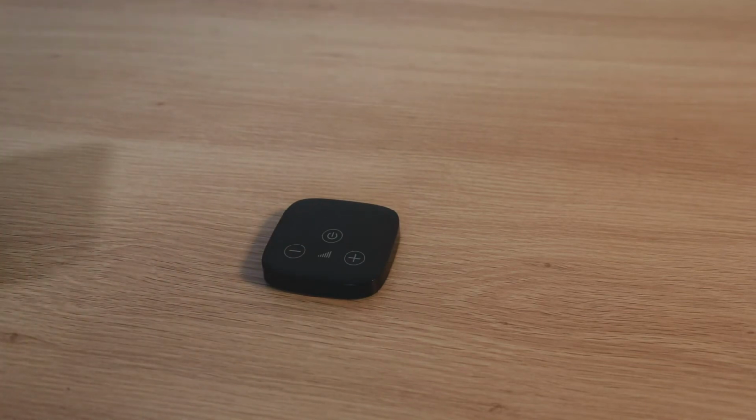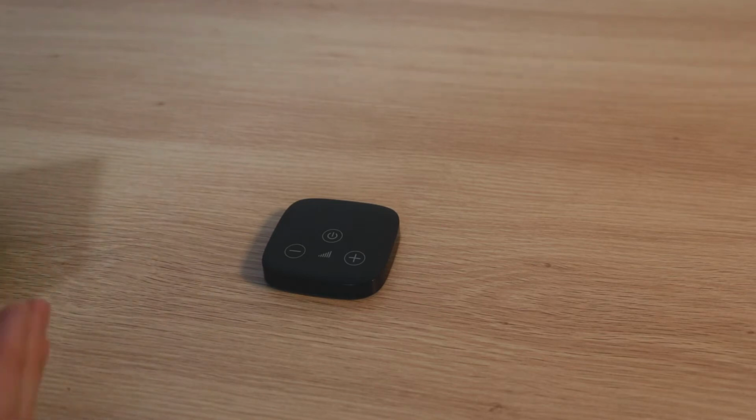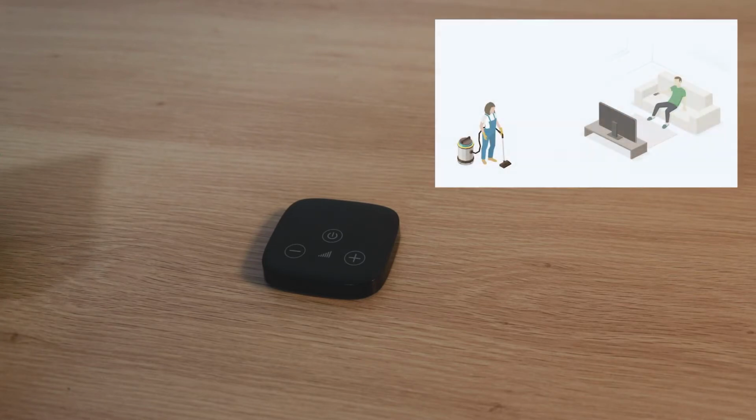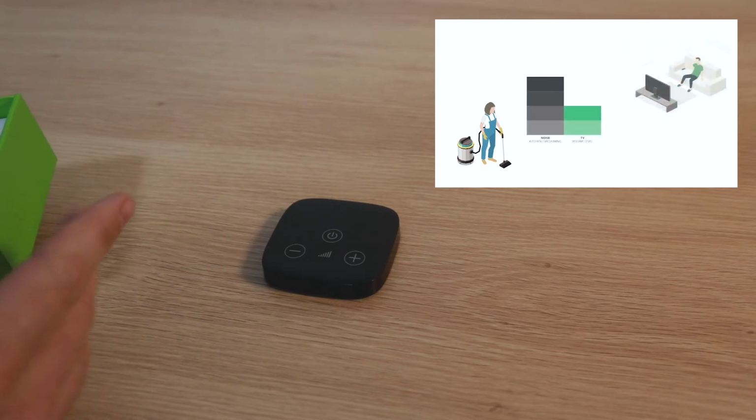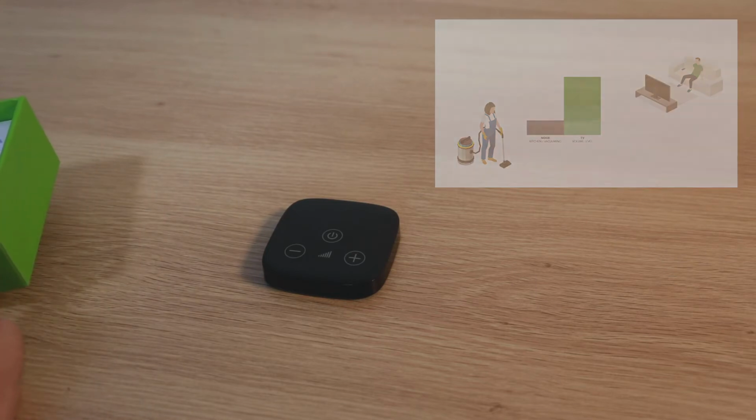When you connect this device to your smartphone, for instance, it also gives you the ability to have a balance adjustment on the app. This will be done in the clinic. Your connection with your smartphone to your hearing aids will be done by your audiologist at Ear Deals. But for your knowledge, you can balance the volume of the TV to the environmental sounds outside. For instance, say someone's in another room vacuuming and that's causing some interference with your viewing. What you can do then is balance more TV volume. Obviously, you can turn the volume up and down, but balance more TV coming through your hearing aids from the TV connector, rather than picking up some of that outside ambient noise.